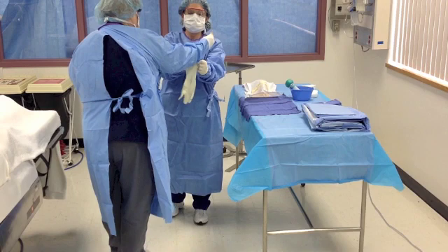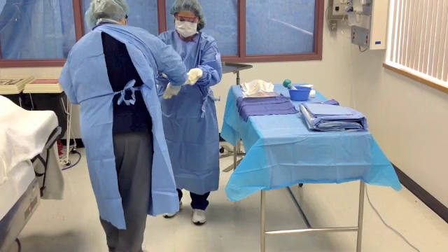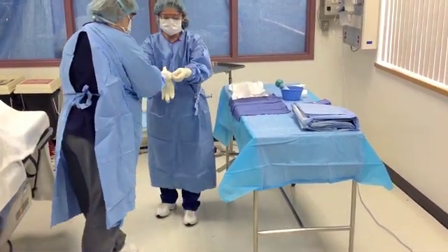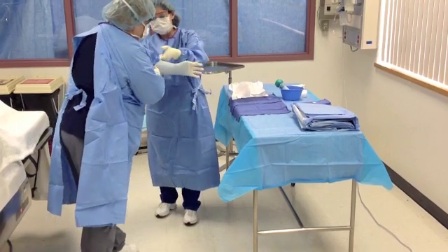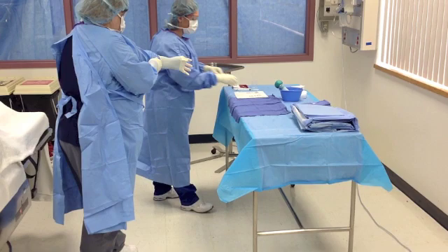Orient the glove so that the thumb of the glove is facing the surgeon. While keeping it spread open as wide as possible, extend the glove towards the surgeon. The surgeon will put his or her hand into the glove. Make sure the glove covers the white cuff of the gown fully before letting go. Don't let go so quickly or the surgeon will get popped like a rubber band. Repeat the process for the other glove. When gloving the second hand, the surgeon will more than likely assist by grasping the glove cuff opposite from you and pulling before sliding the glove on.